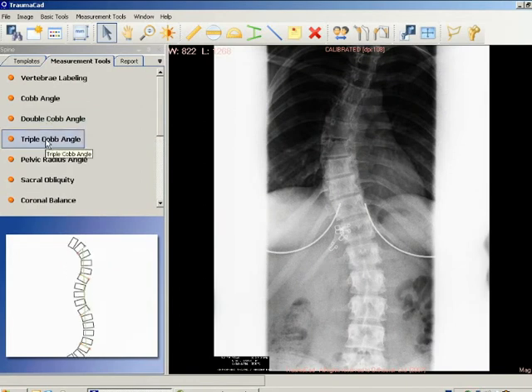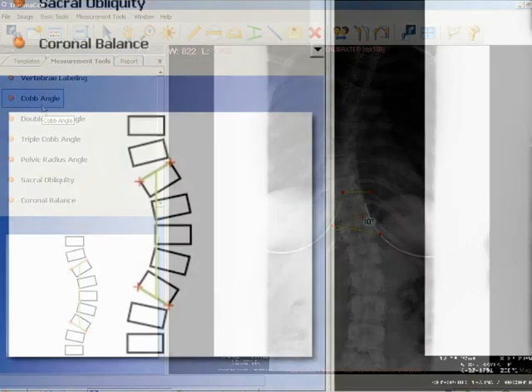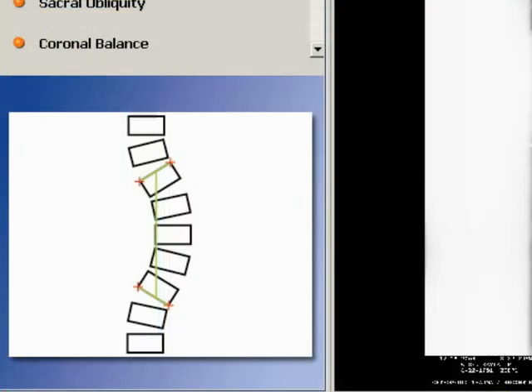When assessing a curve, the apical vertebra is first identified. This is the most laterally displaced and rotated vertebra with the least tilted end plate.